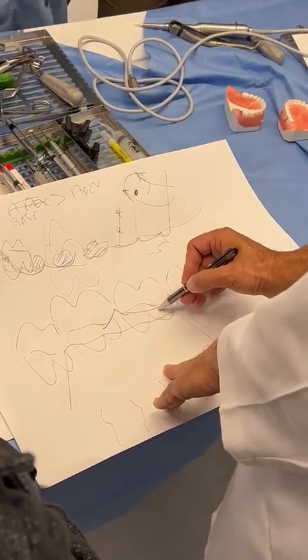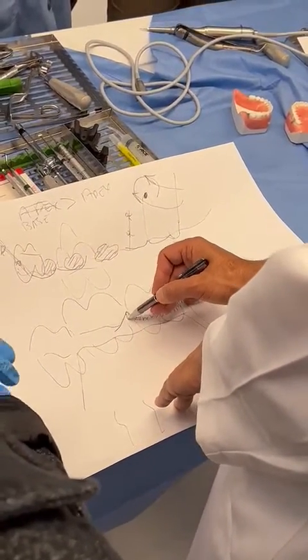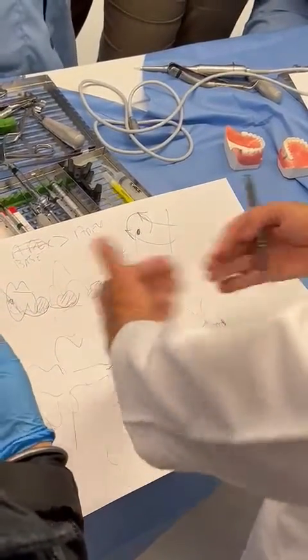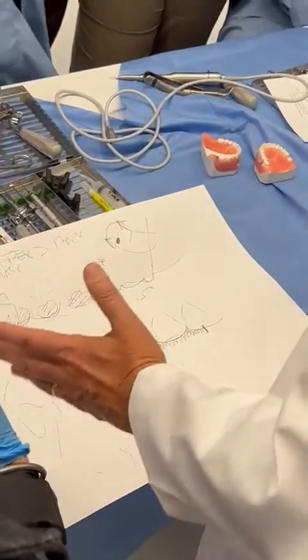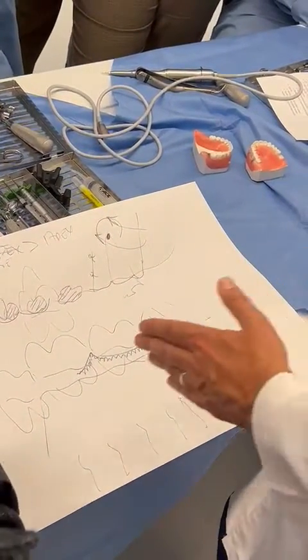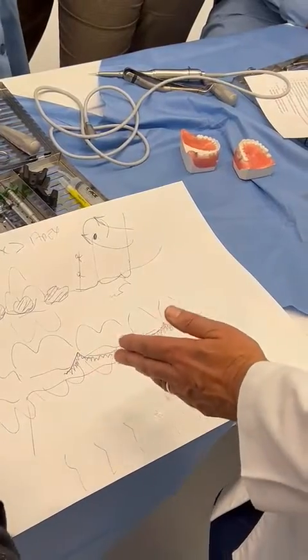You might consider this the marginal gingiva, right? It's not as keratinized as what's below. So that's what we're going to take. We're going to reflect that. Wide, long envelopes will preserve the integrity of the flap so it doesn't tear. 2 papilla forward in the posterior.